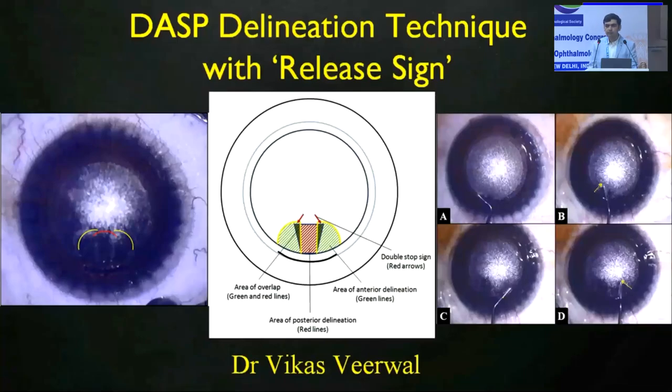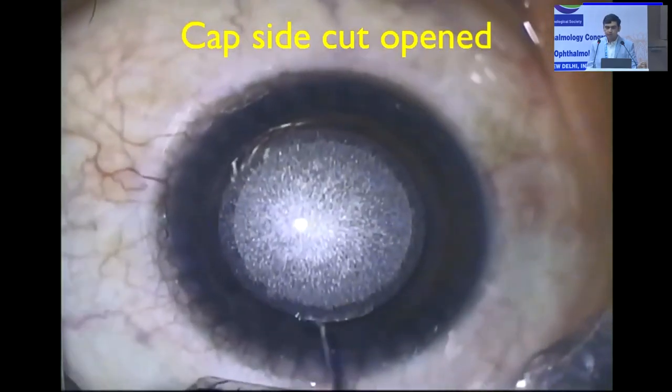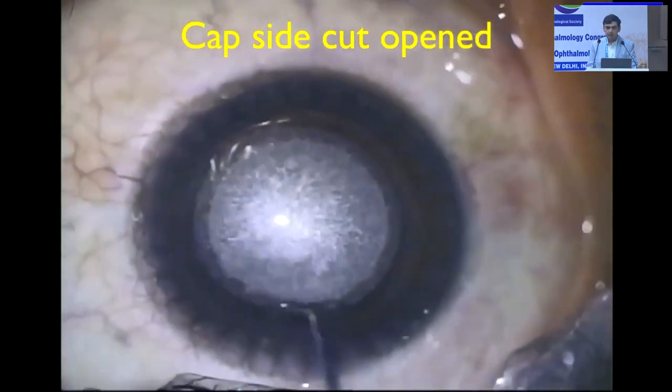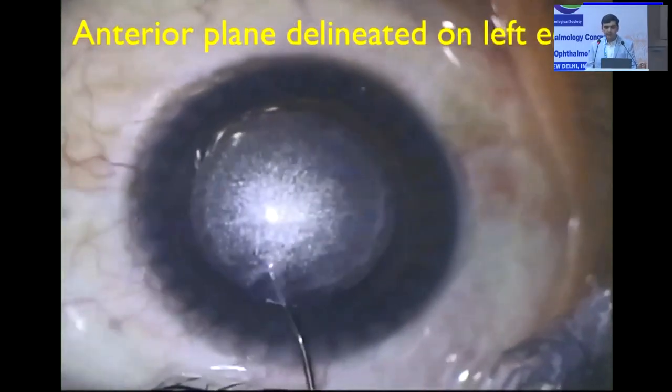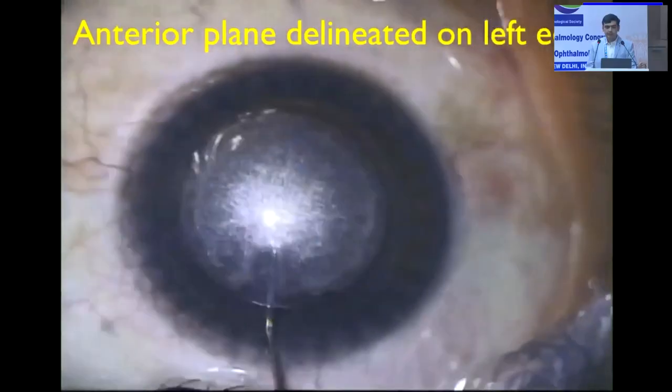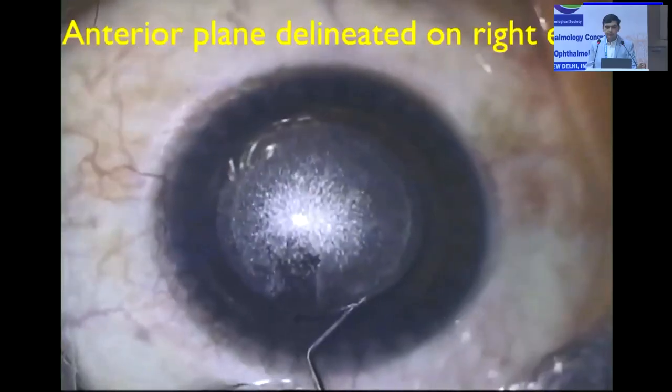In this technique, we propose that there are 2 areas of anterior lenticule dissection delineation which we do on both the sides of the cap side cut. Here also the maneuver of entering of the dissector is first sideways between the cap and lenticule edge, which is turned curvilinearly inwards towards the anterior plane to get to the anterior plane itself. So after opening the cap side cut, the dissector is entered in between the edges of the lenticule and the cap edge and turned curvilinearly inwards to automatically enter the anterior plane. The same process is repeated on the other side.